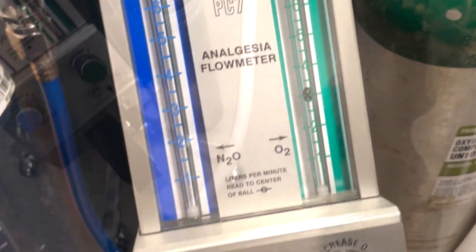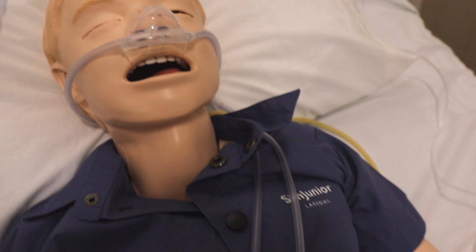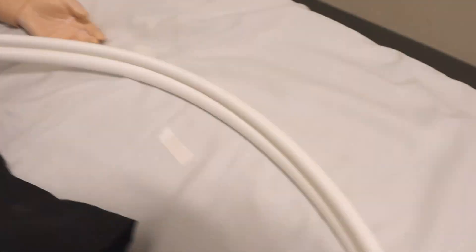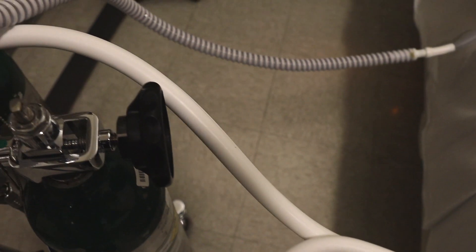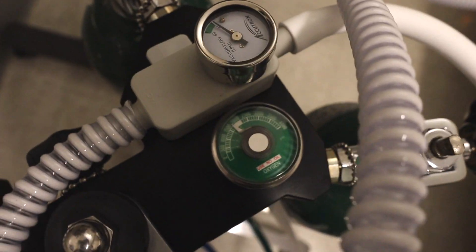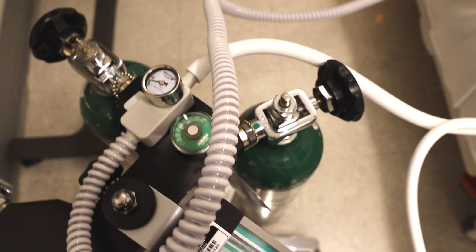In addition to maintaining the airway as in any procedural sedation, it's the RT's job to monitor the scavenger unit and suction gauge, adjusting the lever to keep suction in the green zone throughout nitrous administration. You don't want any staff breathing it in during the procedure. Dr. Anabir will now discuss proper use for physicians.